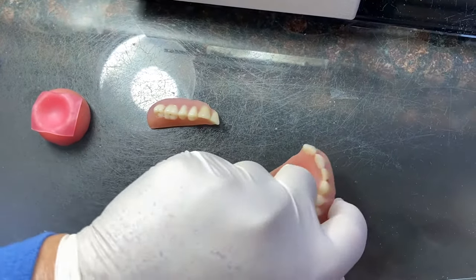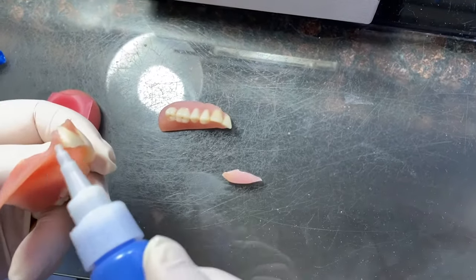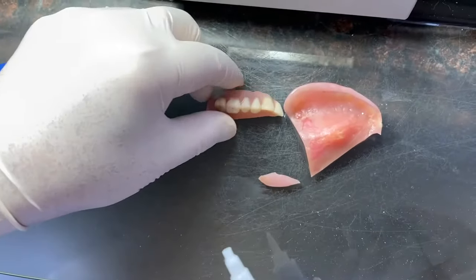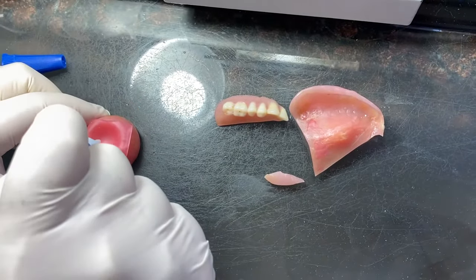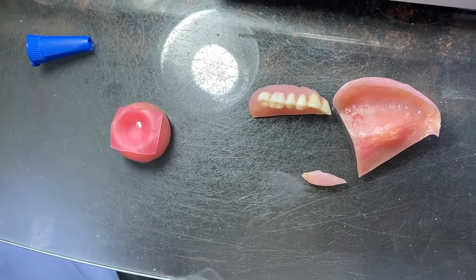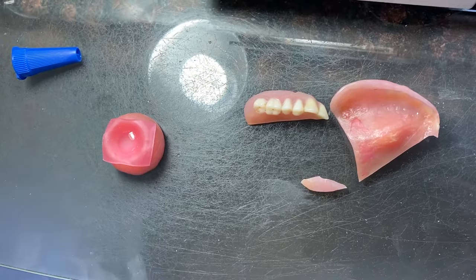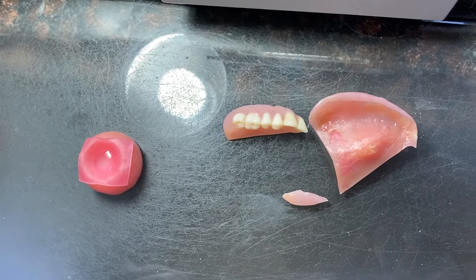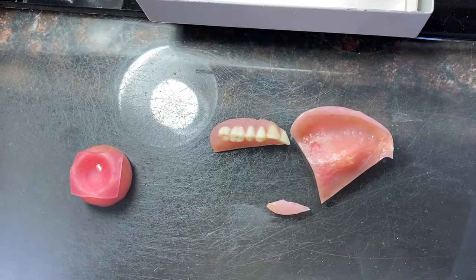When you're gluing the denture, do not put glue in here — that's wrong. You have to put the glue in there somewhere, or in the back of the glass, or anything you have.